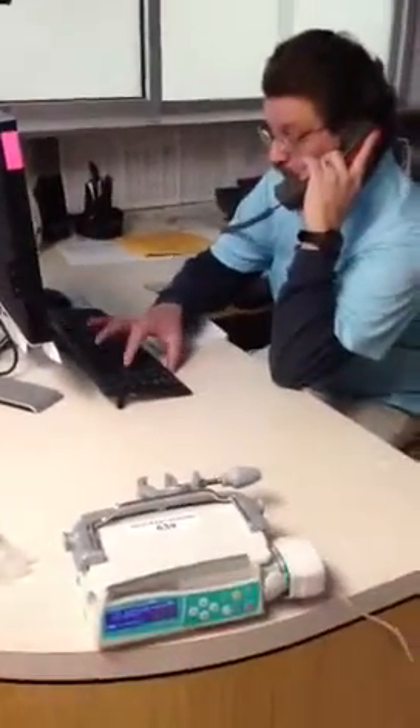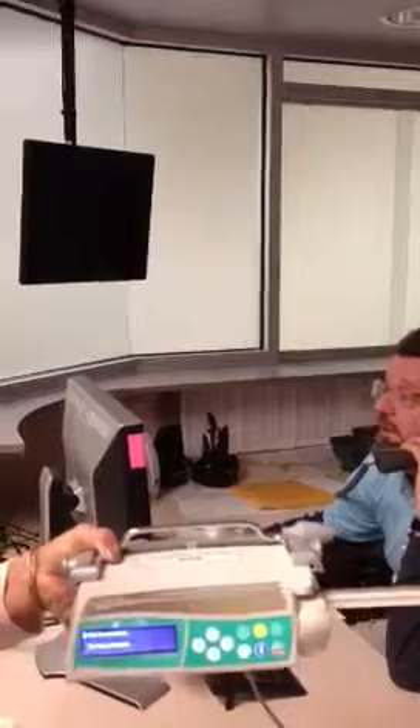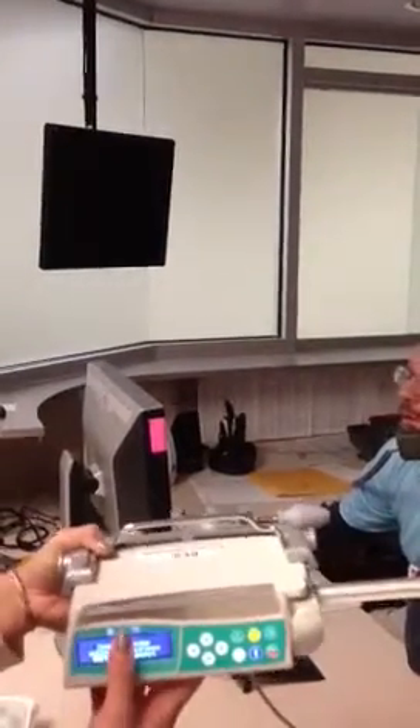Next, you're going to power on the pump. Here's your on-off button right here. Press that one time and it'll go through a set of self-checks. You'll see an automated drive arm — your drive arm will extend out. The alarm you just heard was that the battery is empty, so we'll press OK to silence that alarm. We're charging this pump, and it will operate with it plugged into the wall.